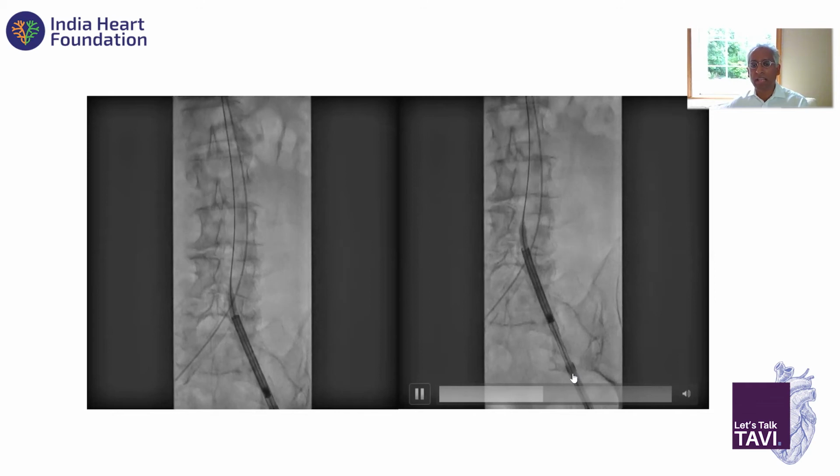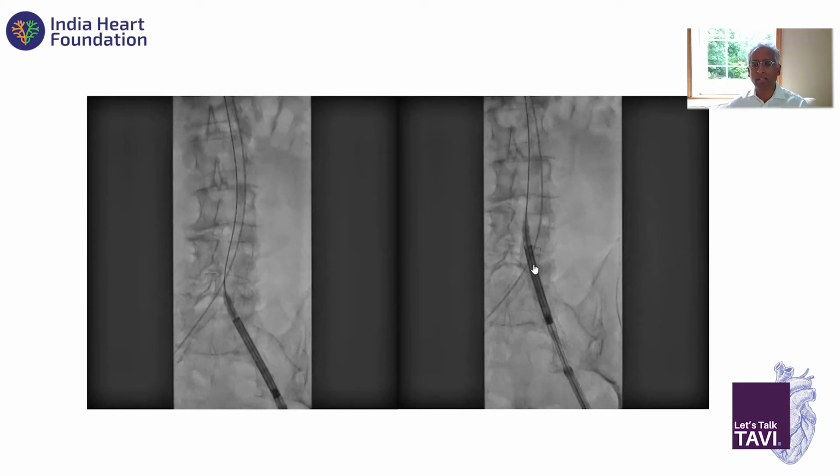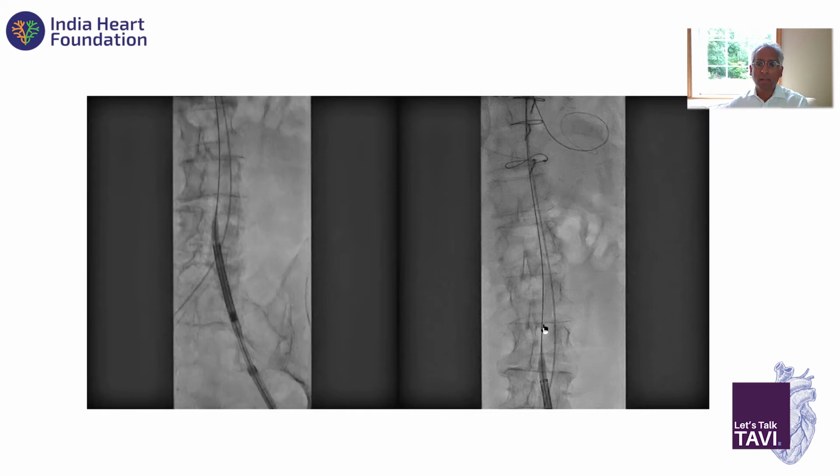You can see that the inline sheath is already separated from the capsule. That's fine because the patient was quite short. Half of it, a bit like what Sai shows, half of it is in the patient, the other half is on the outside, and it just does not go. I twist and turn 10, 15 degrees, just does not go. And this is now, I think, a composite of the anatomy, a composite of the calcification.